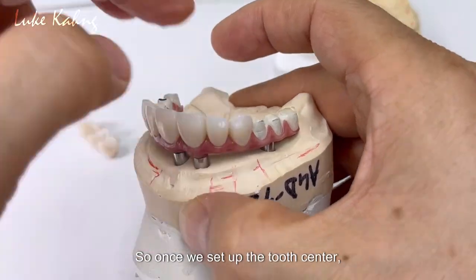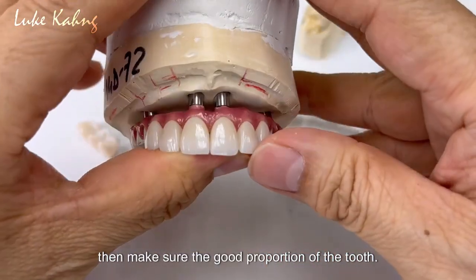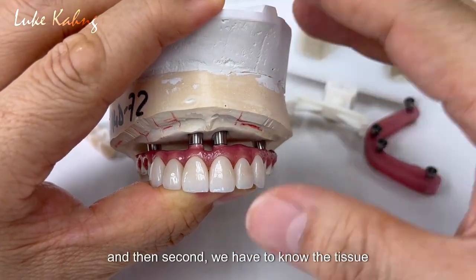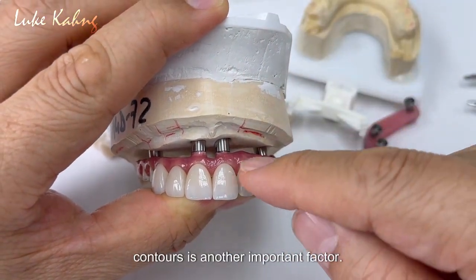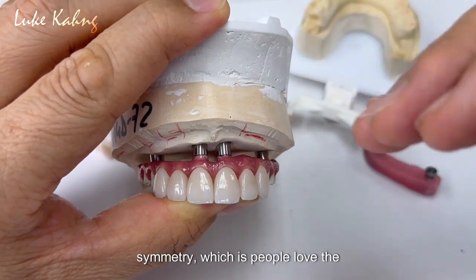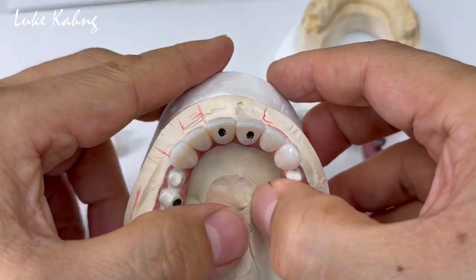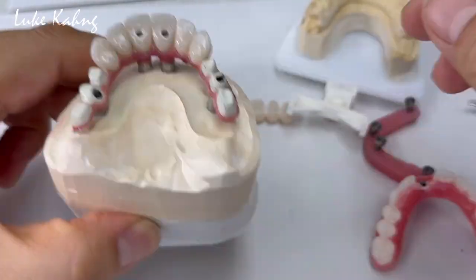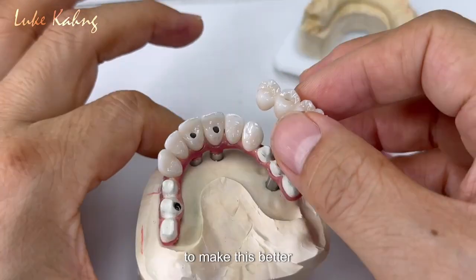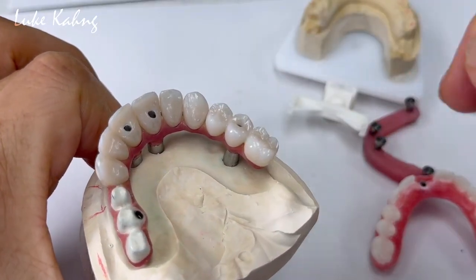Once we set up the tooth central, which is very imperative, we make sure the good proportion of the tooth. The laterals we move it, and then we have to know the tissue contours — another important factor. Then canine to canine to make the good symmetry, which is what people love. So this is the guidance for canine to canine, and the zirconia bridge is monolithic to make this better retention.